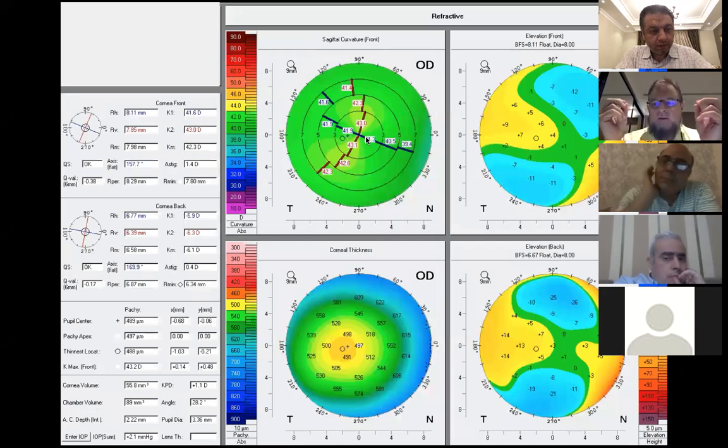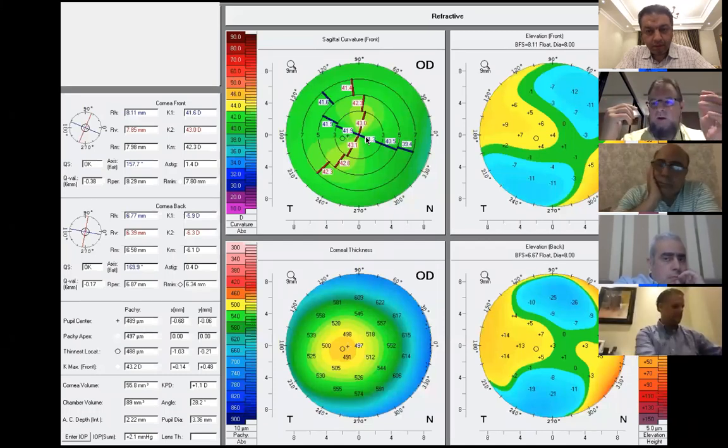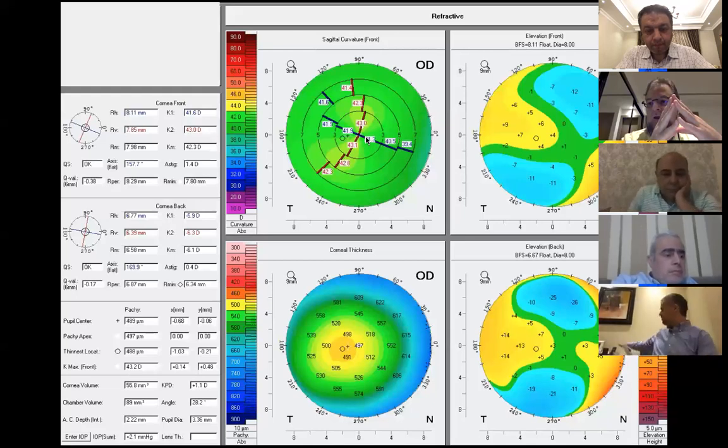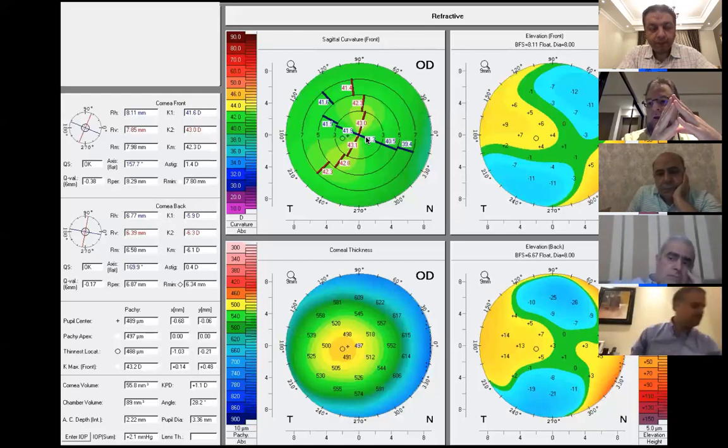Usually, the Kmax is more than 1 diopter different from the Km when there are artifacts like dry spot, as you mentioned, dry eye, maybe misaligned, or something on the corneal surface or in the cornea itself, or ectatic corneal disease as well. So in usual cases, there will not be much difference, and we apply on Km.